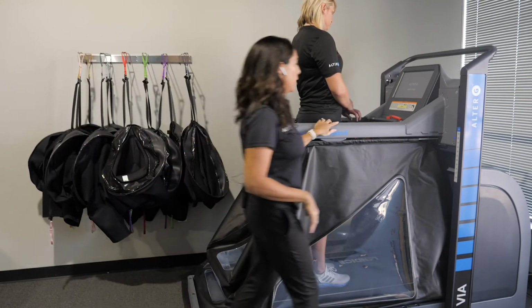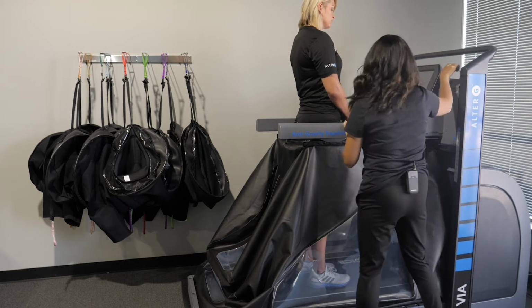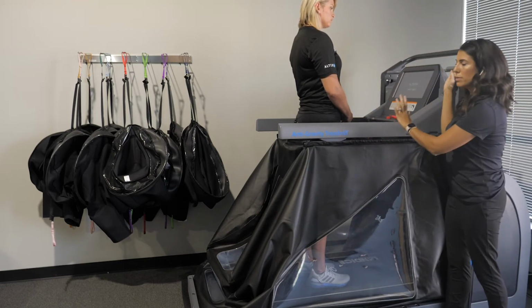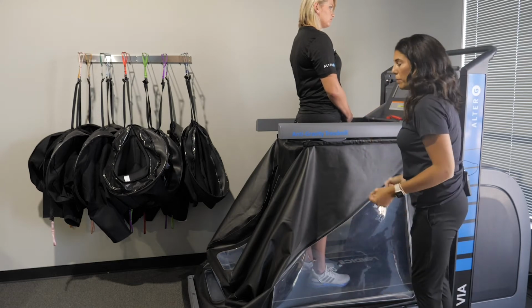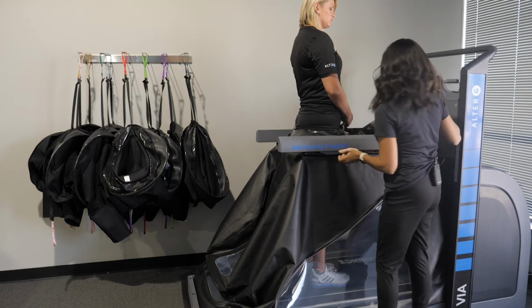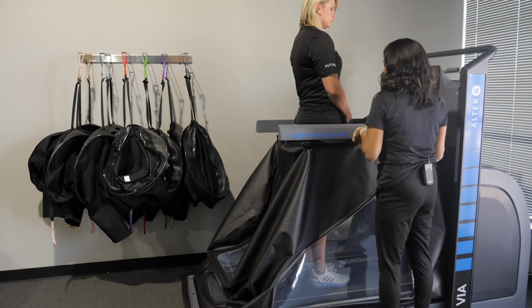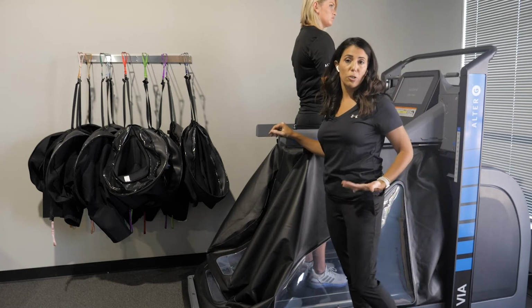So this bar height here, I don't know if you guys can see, but there's a handle here that unlocks and locks this frame. Unlike the previous model where we had to pull up the frame, we can actually lower or raise the frame height. Ideally we want the frame to be at the level of the greater trochanter.